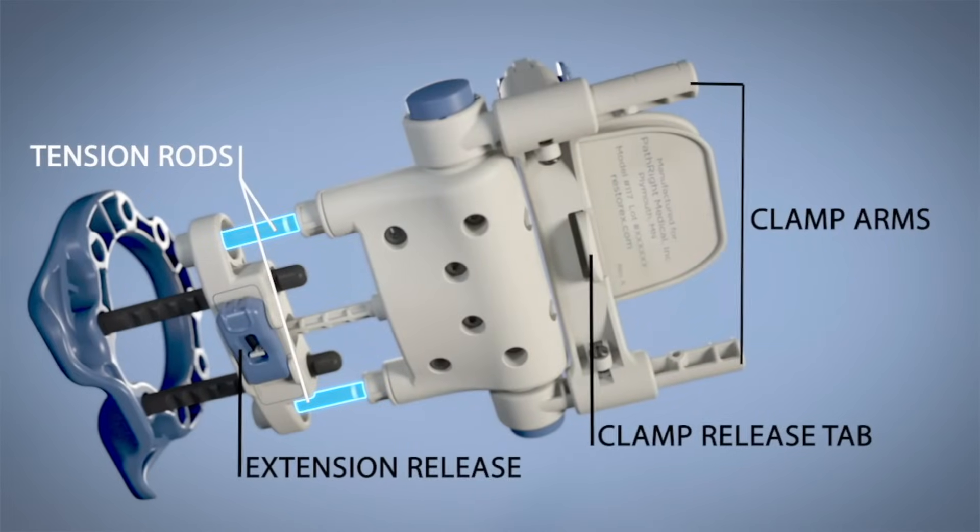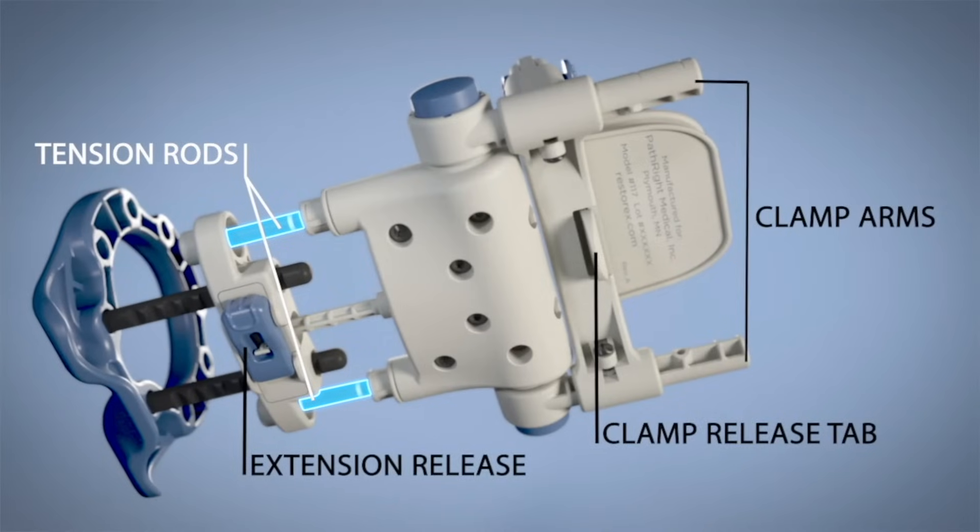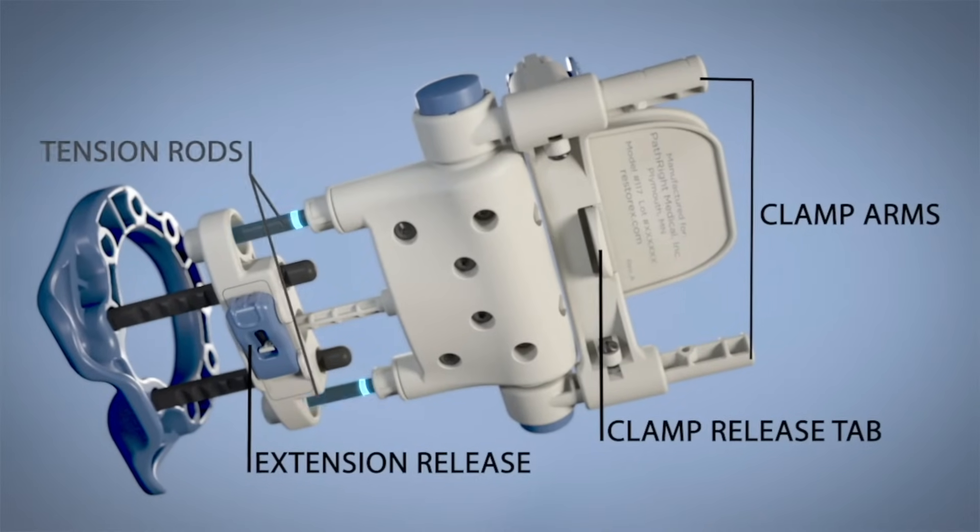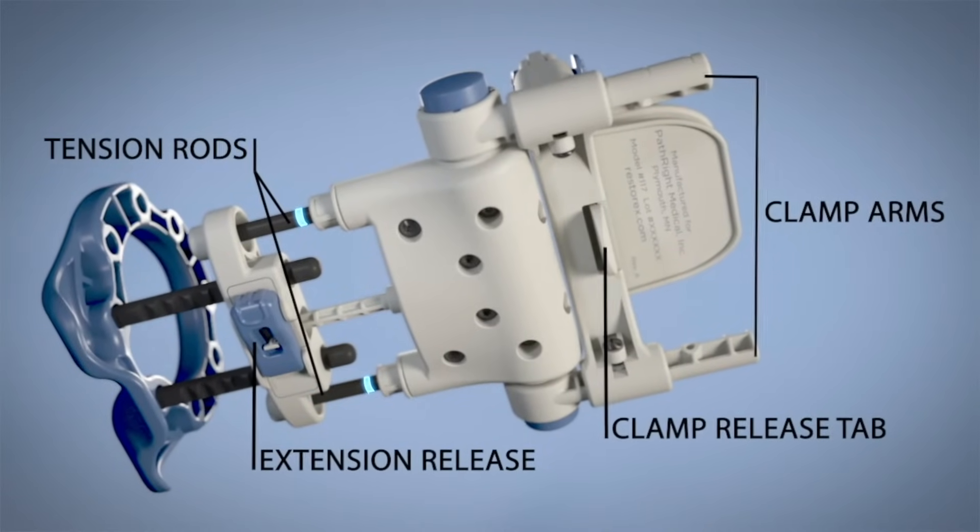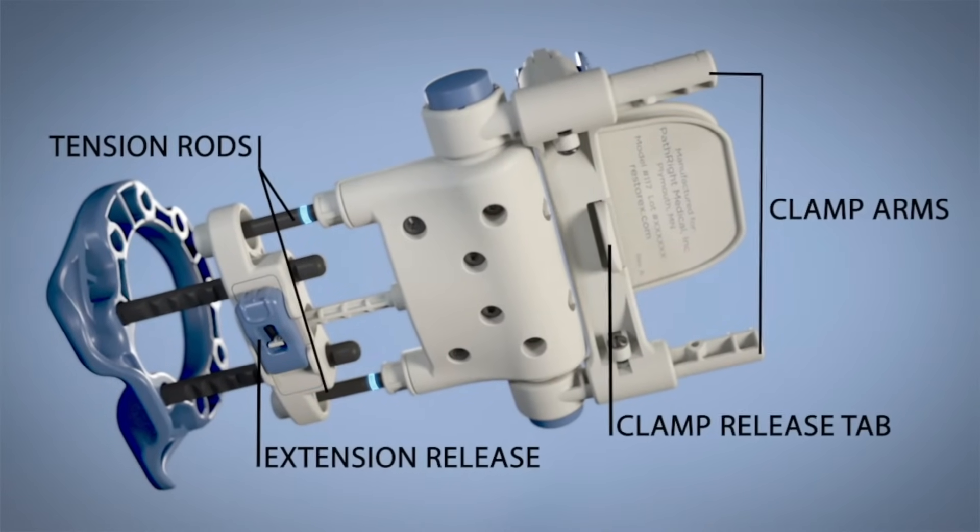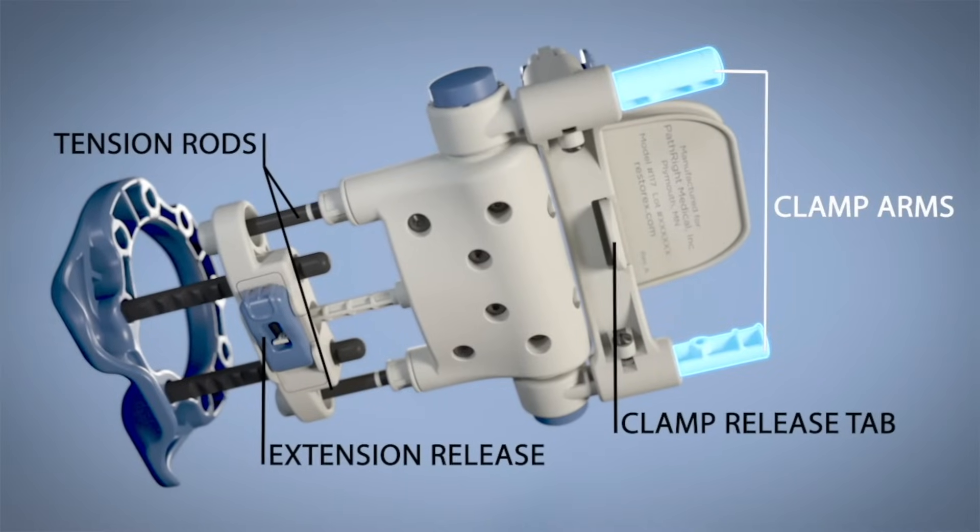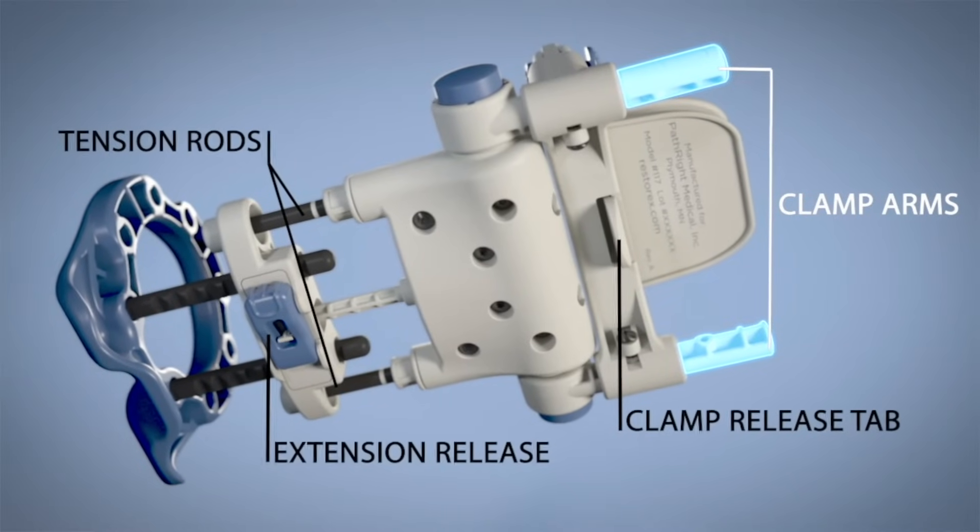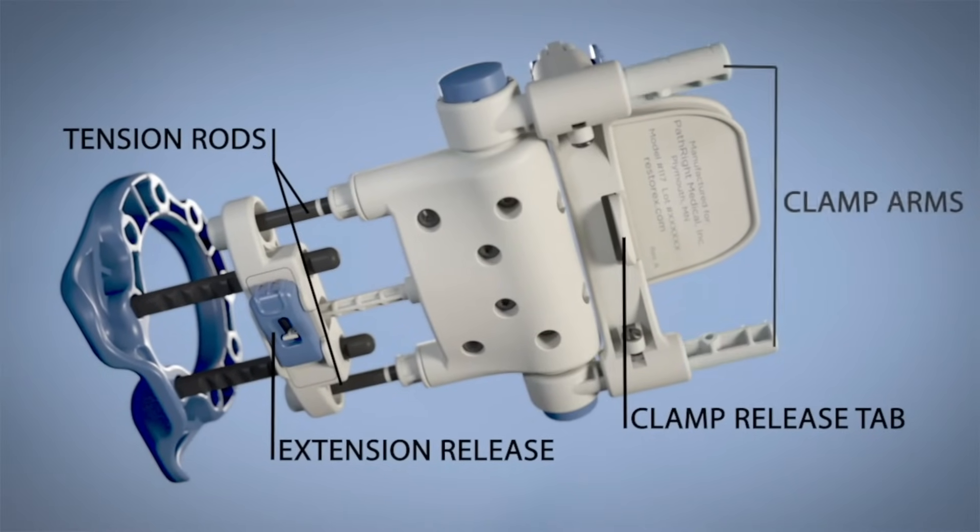The spring-loaded tension rods provide the resistance to achieve traction. The white band on each tension rod tells you when you have achieved the minimum tension level. The clamp arms are used to adjust Restorex for the distance from the tip of your penis to the Peyronie's curvature.